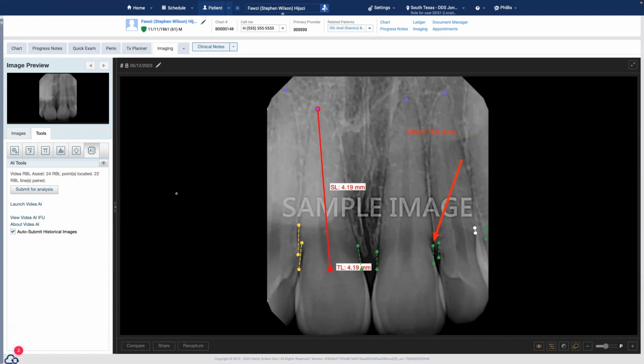Yeah, and I wanted to add a few things at the end: the impact of this technology on dentistry is going to be huge. Everybody's going to be using this. If you're not using it, you're not keeping up with the times. The insurance companies are using it. The DSOs are using it. The different group practices are going to be using it.